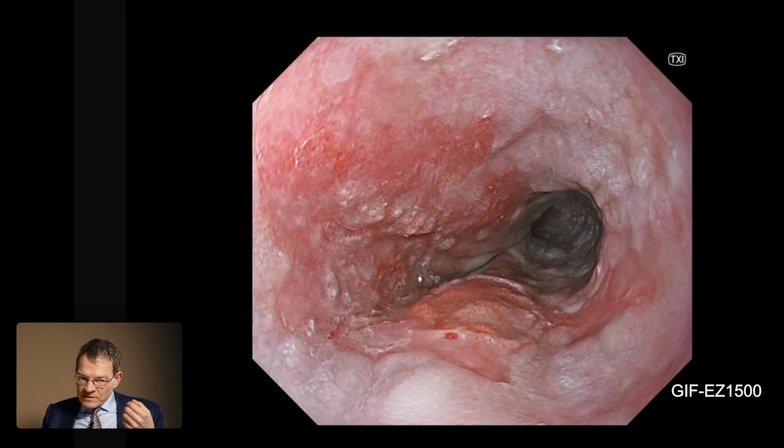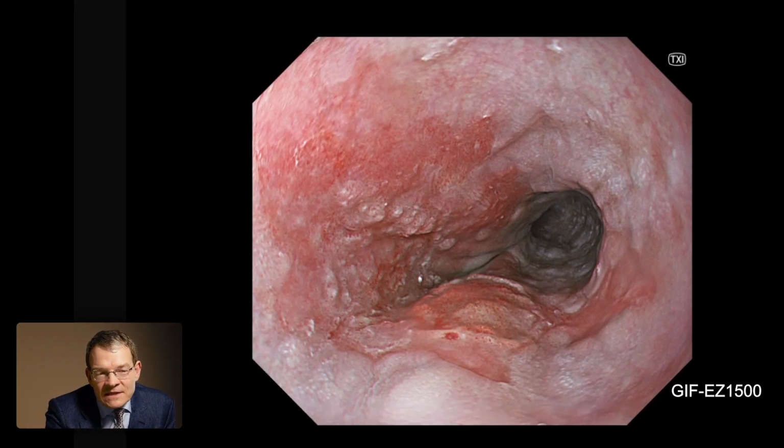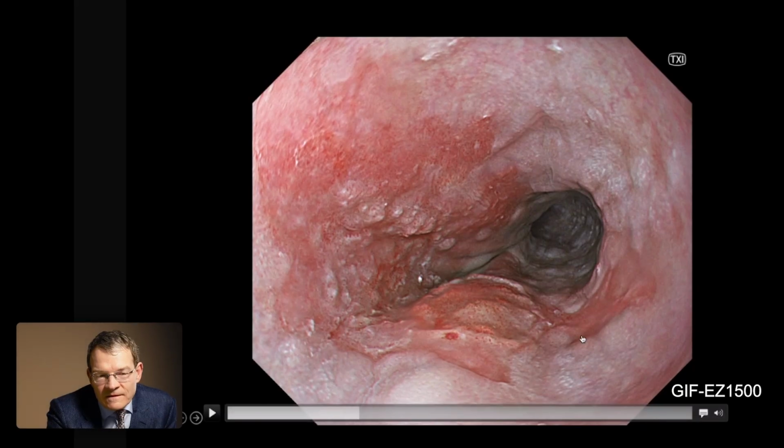You're right. So the first what we see in the white light is that the lesion or the suspected area is a little bit more reddish, and then you should focus your eye on this area. But now we have the so-called better white light, the TXI, and here in this case you may appreciate that we can see this abnormality already better. And I think it's also very interesting, the more structural abnormalities you have of a lesion, the more visible this is with TXI. And here we have a lesion with different cancer infiltration depths.